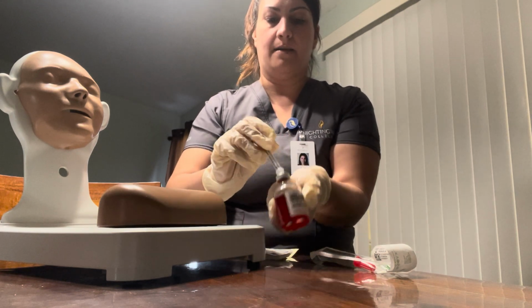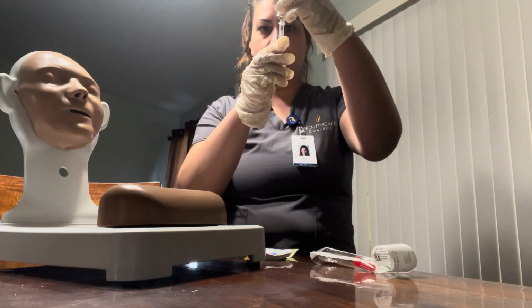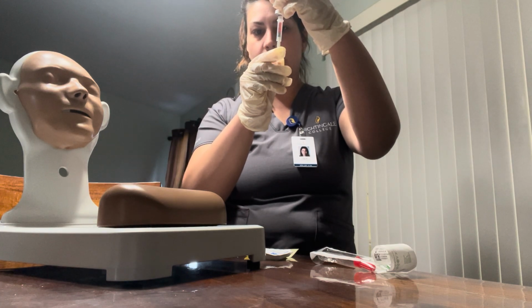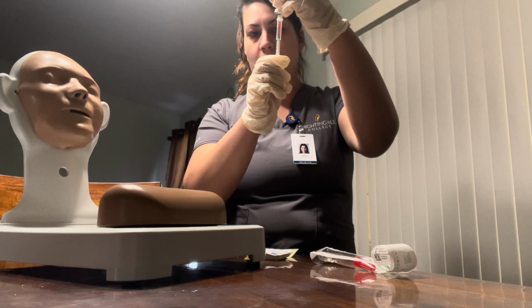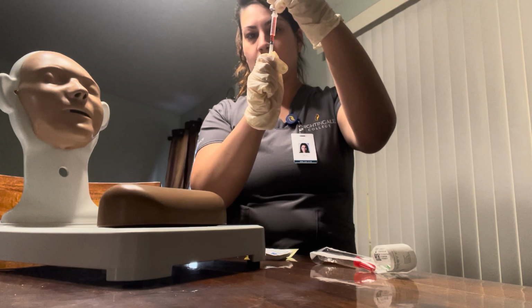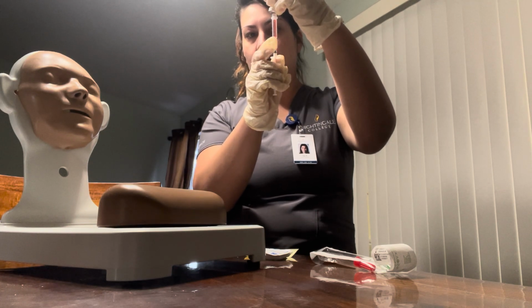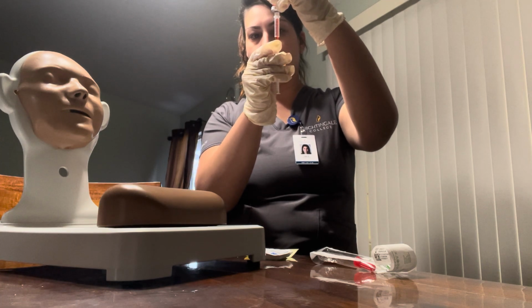I will flip it upside down and I will draw in 1 milliliter of medication. I'll make sure that there are no bubbles, which in this case we are good to go.